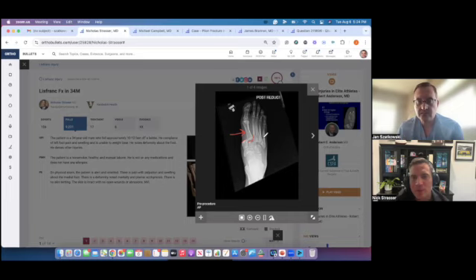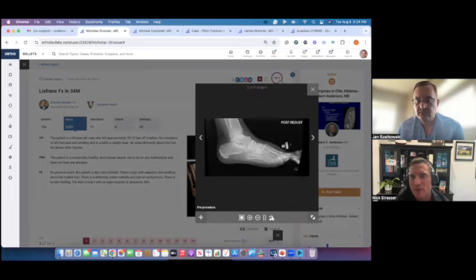We were just doing foot and ankle emergencies this morning in our own lecture, and we were talking through strategies to facilitate reduction in dislocations like this. This is a hard dislocation to reduce in the ER. It depends on how quickly they present, how swollen they are, and the anesthetic you can get. If they're not very relaxed, there's probably not a great chance you're going to get it, and they never look quite perfect when you're done. Do you have any strategies for how you teach your residents to manage these?